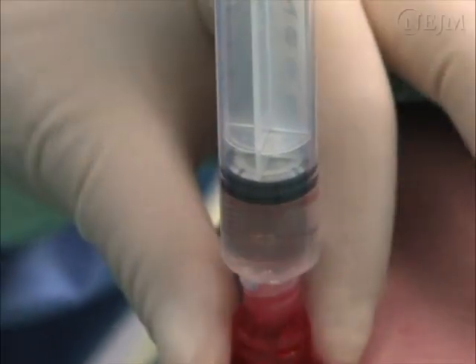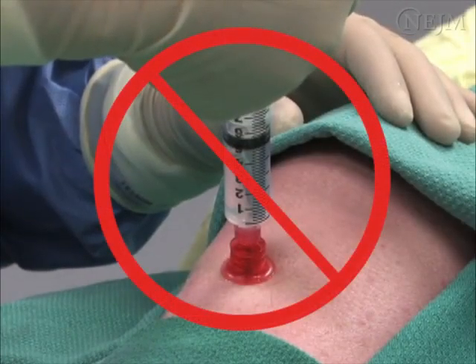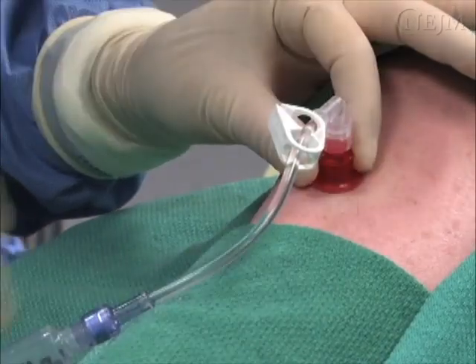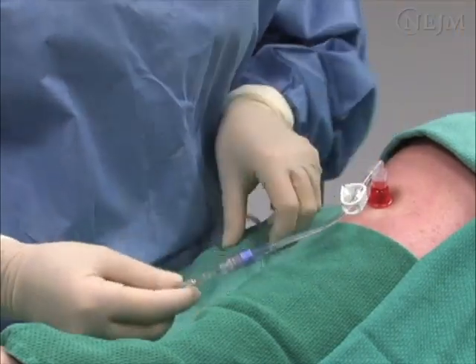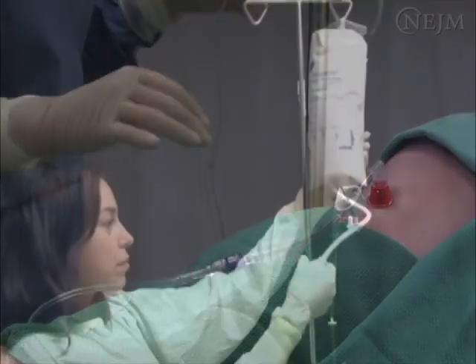The fluid should flow easily with no resistance. If the fluid does not flow, select another insertion site. After correct placement has been confirmed, the test syringe can be disconnected and the intraosseous needle can be connected to regular infusion tubing. Fluids can be infused by gravity, but infusing fluids through a pressure bag produces better flow rates.